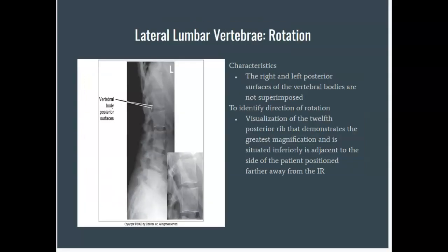Let's talk about identification of rotation in a lateral L-spine projection. Rotation can be detected on a lateral lumbar projection by evaluating the superimposition of the right and left posterior surfaces of the vertebral bodies. On a non-rotated lateral projection, these surfaces will appear superimposed as if they were one. However, on rotation, the posterior surfaces are not superimposed — one is demonstrated anterior to the other.